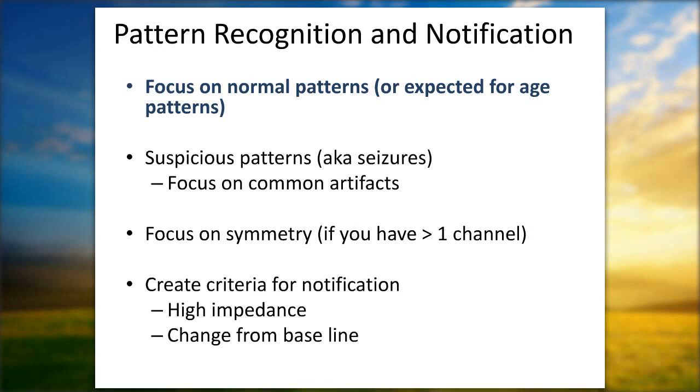So just as a recap, I think it's important when we're talking about cooling babies and teaching bedside staff, to think about not only what is normal for age, but what's expected based on some of the other history things that we've just talked about. And it's one of the primary things that I focus on the most when I'm teaching bedside staff. So I hope that was helpful. It's just a little overview and a few talking points about cooling in aEEG.